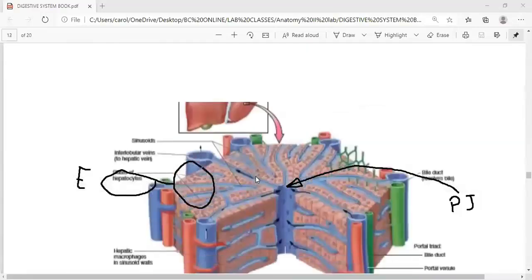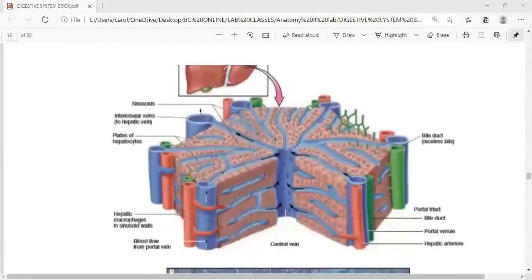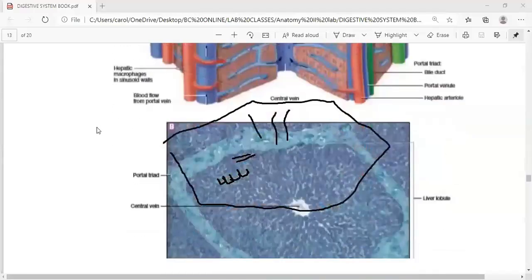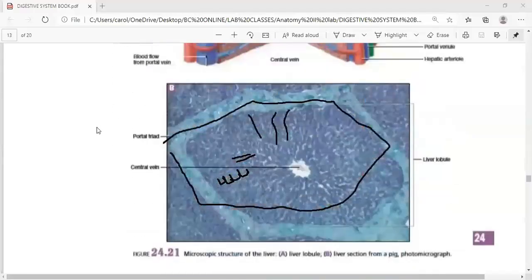And we keep going down. When you cut the liver and put it under the microscope, you're going to see that the cells in the liver are kind of like cubes. These cubes are next to each other, forming a train like that, and they form this hexagonal structure that you can see right here. This is what you see right here. When you look at the real picture, it matches more or less with my drawing, where you can see the hexagon, right?